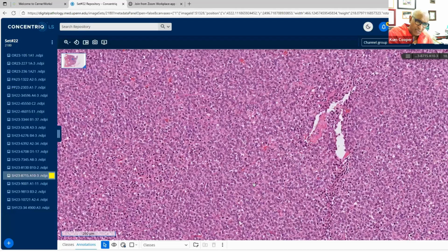We did do the SYT FISH analysis in this, and that was negative as well. We did the EWSR1, as I recall, and that was negative as well. We were just getting our FISH analyses out of the way. But ultimately, we sent this off for sequencing. And I'm going to tell you why and what I queried, because I also did a WT1. Okay, not for mesothelioma, but for CIC-DUX4.